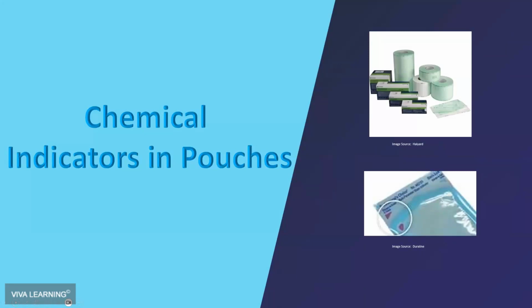If you use pouches that only have external indicators, you need to add a strip into the pouch that measures at least 2 of the parameters, preferably all 3 parameters for sterilization. If you use a cassette and you wrap the cassette, you need to put an indicator strip inside of the cassette.